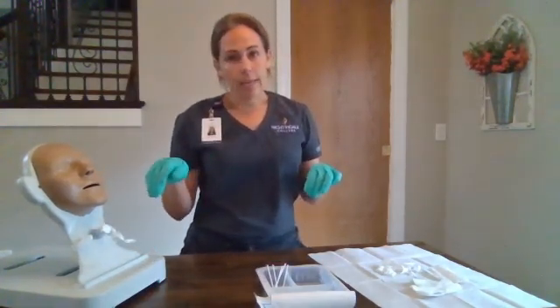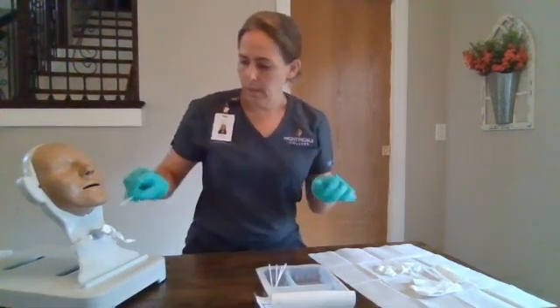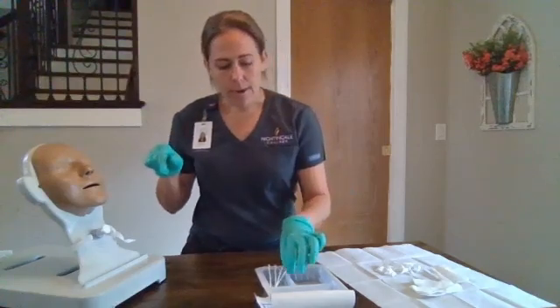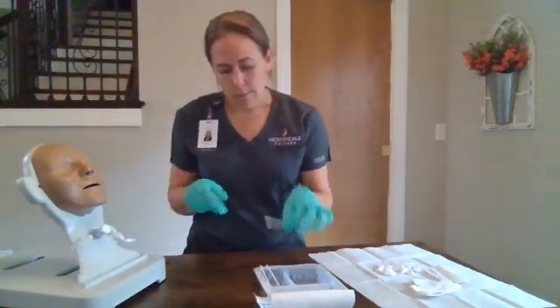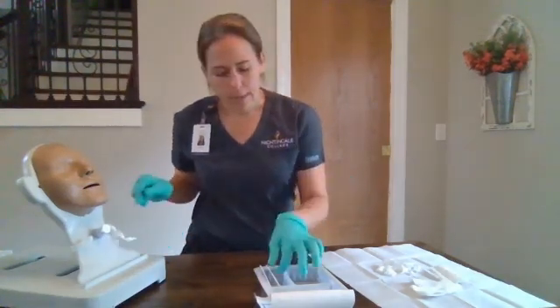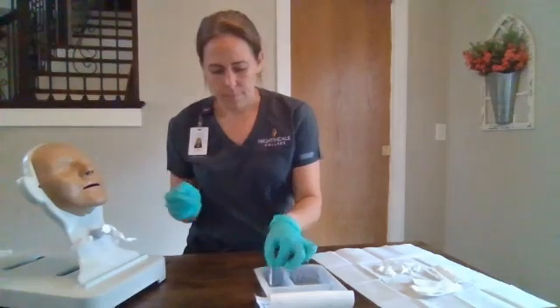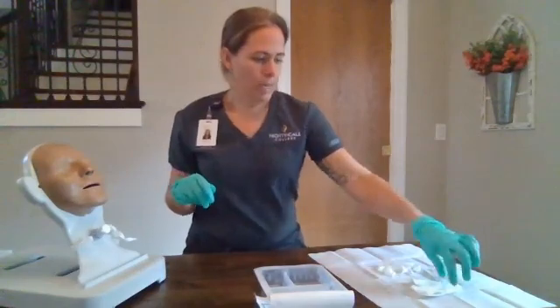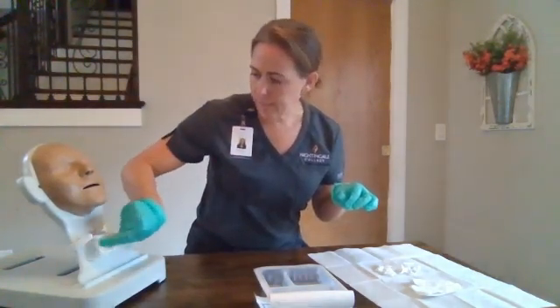Next, we're going to clean the skin and the flange. We'll take our swabs and clean approximately 5 to 10 centimeters around the stoma as well as the flange. We can use this opportunity to inspect the stoma and ensure there are no signs of infection or skin breakdown. Clean the flange as well.